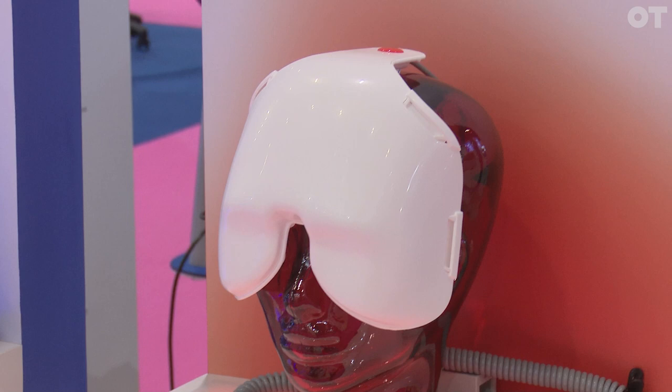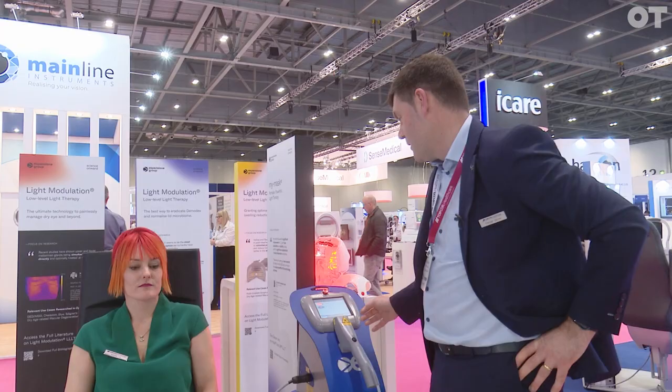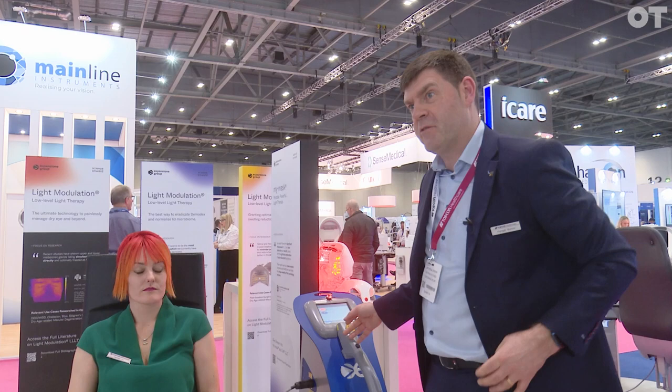It's a series of LEDs. The patient wears the mask for 15 minutes post-IPL treatment, so we do a combination of IPL and low-level light therapy. The IPL is just five shots on the lower part of the eye, and then the mask afterwards for 15 minutes. The advantage of the mask is that it's treating the upper lids and the lower lids simultaneously. Whereas when you're doing IPL on its own, you're really only treating the lower lid, which is only half of the problem when talking about meibomian gland dysfunction and dry eye.